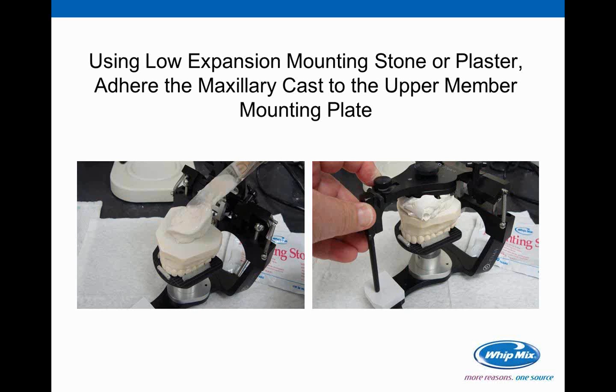Okay. Now you're going to use a low expansion mounting stone or plaster. A lot of technicians just use any plaster they can find in this particular procedure, and that actually can get in the way of what you're doing, because that plaster is going to mount, it's going to move, it's going to expand when you mount, and it's going to push your models into different relationships. So you do want to use low expansion material.